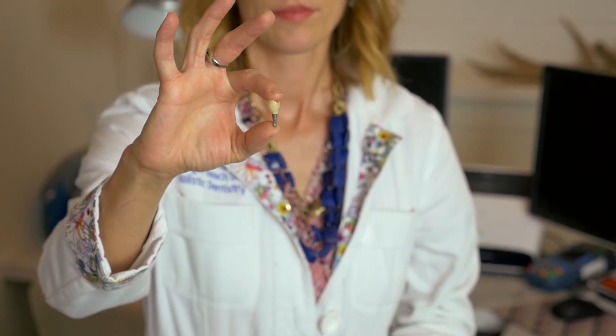Now what an implant looks like is this. Here's the little post that goes into the bone, and then we have a crown emerging from it. We have some really cool techniques on how to do the ceramic and ceramic parts that go above the gum line, but the past decade or more, there haven't been alternatives for this titanium part that goes into the bone.